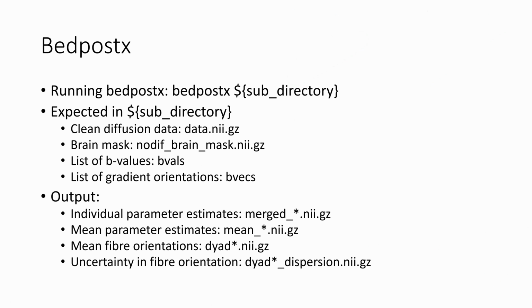So, running bedpost. As long as you have your correct input data, effectively labeled, so you have some clean diffusion data, which you can call data nifti, and you have a mask, and your bvals and bvecs, you can run that subdirectory through bedpost, and it will recreate a mapping of how all these directional gradients can go in light of this probabilistic tracking: what kind of vector could path through to build up this arrangement. And this has the obvious benefit that things that before looked like holes in your FA or decreased areas of FA can now make more sense as path-through areas.